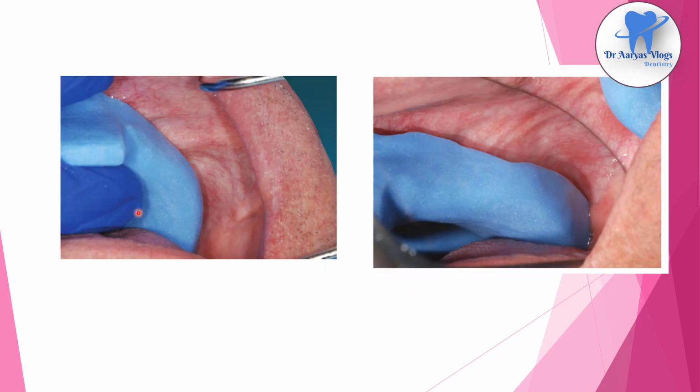Here the impression tray was cut back by 2 mm from the depth of the vestibule on the cast, but the borders of the tray are impinging on the movable tissues intraorally. So it must be shortened. And the buccal and labial flanges of this tray have been shortened sufficiently to create adequate space for the border molding material.